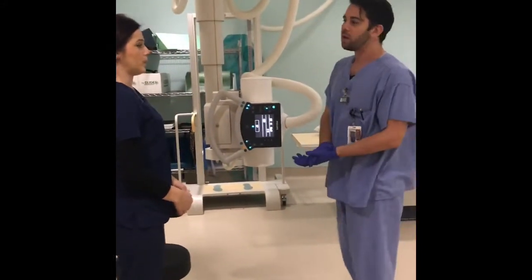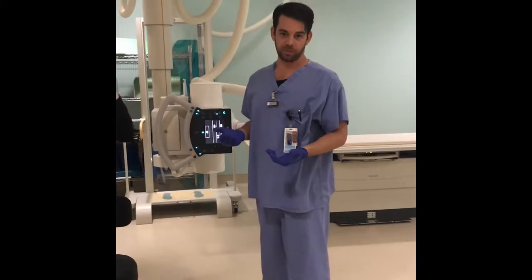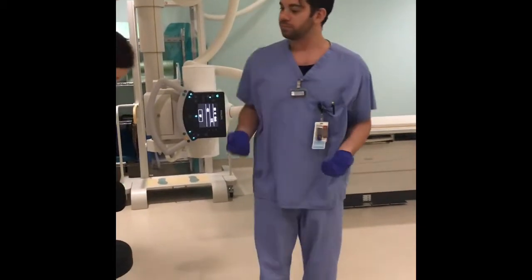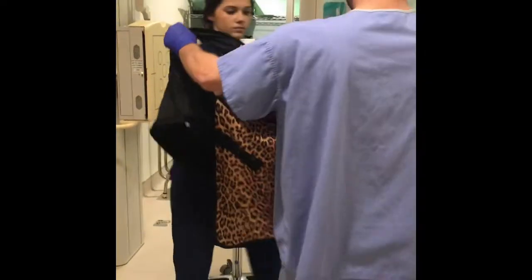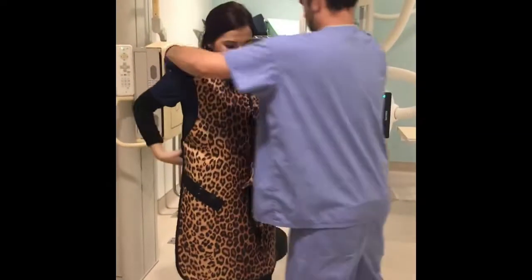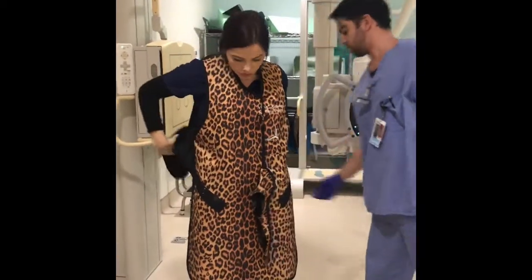Okay. Now, she's not wearing any earrings or any necklaces, but I checked for all jewelry possible. And I'm going to shield our patient now. So, first, we got the shield on, and then these wrap diagonally across.